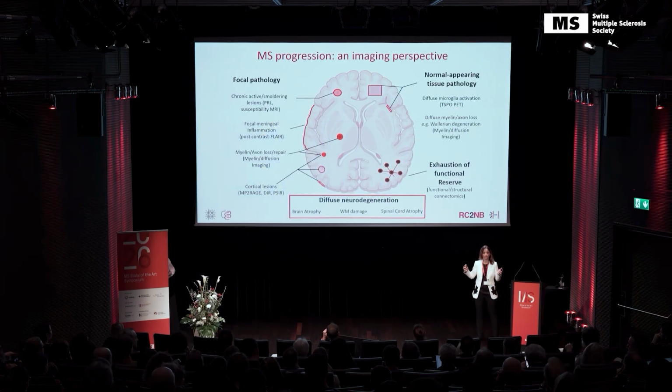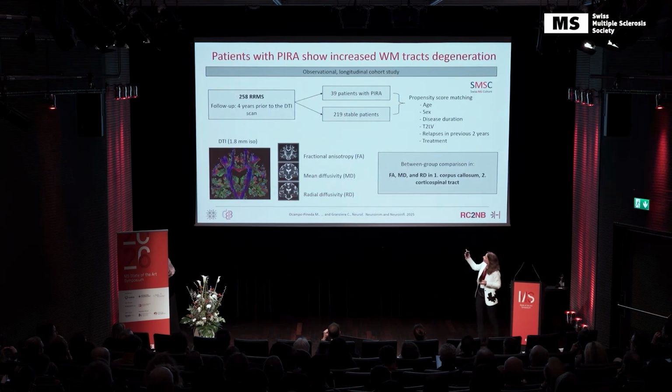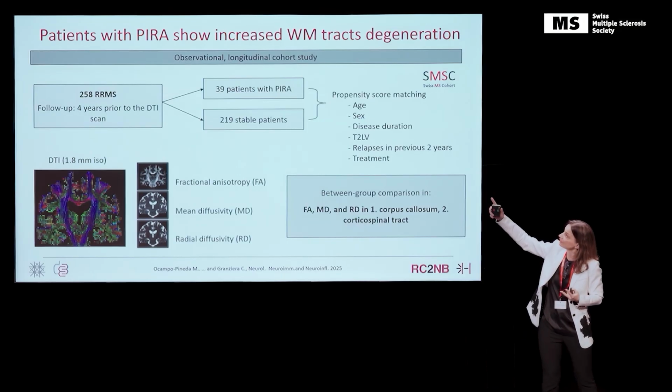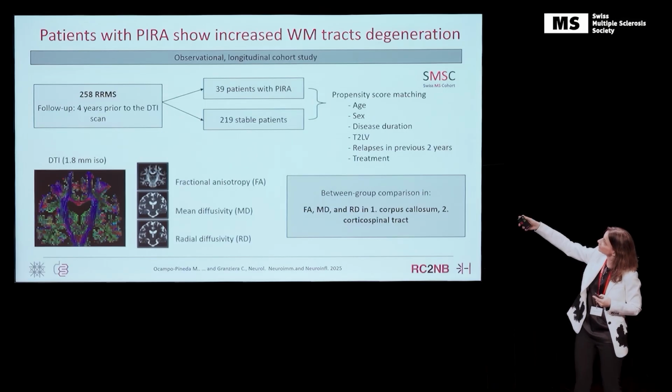And then I would like to confuse with the diffuse neurodegeneration, which means we don't take out the lesions, we focus on the global changes from an imaging perspective in the brain and in the spinal cord. And again, studies from the Swiss MS cohort. The first one is the one that showed that we wanted to look at these tracts, white matter tracts that we can image. And you see here, not all the centers have this DTI protocol, so we used the data that we had. We analyzed these 3 parameters.